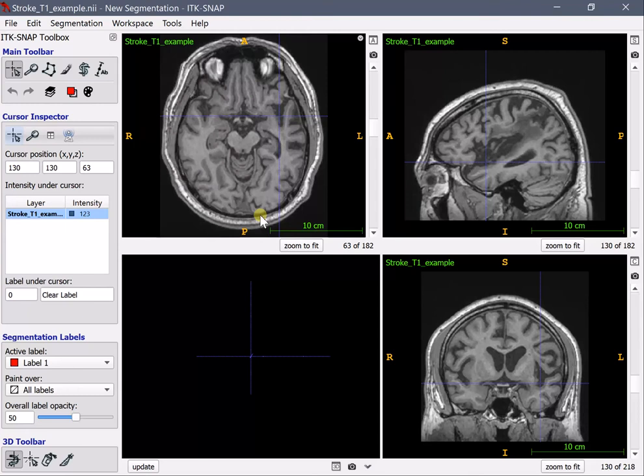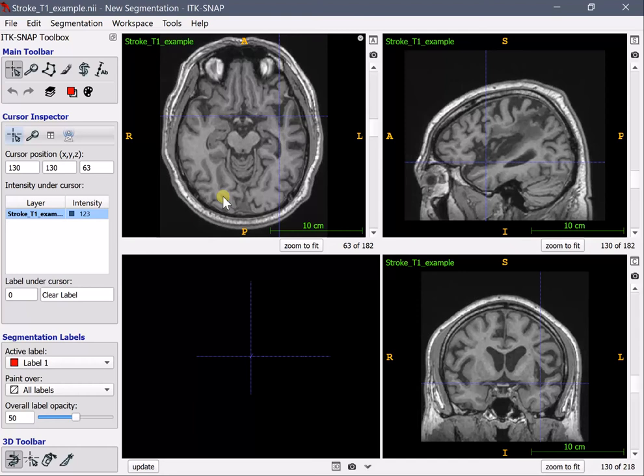What the segmentation is is nothing else but another image that is overlaid on top of yours and when you start to draw on this image you'll actually be changing the values of the voxels in this hypothetical virtual empty image.